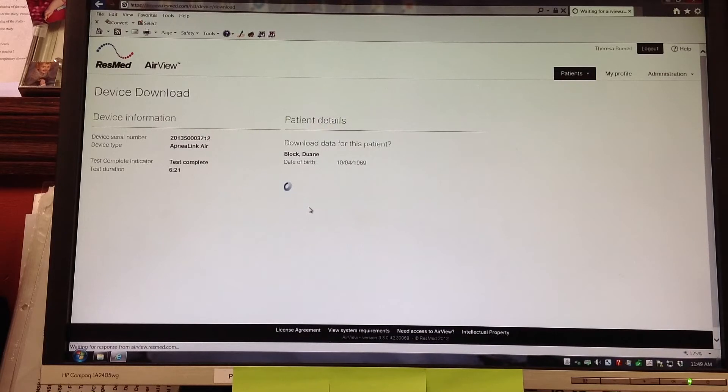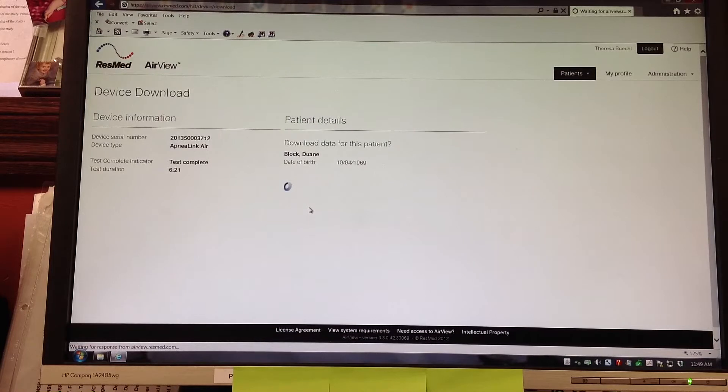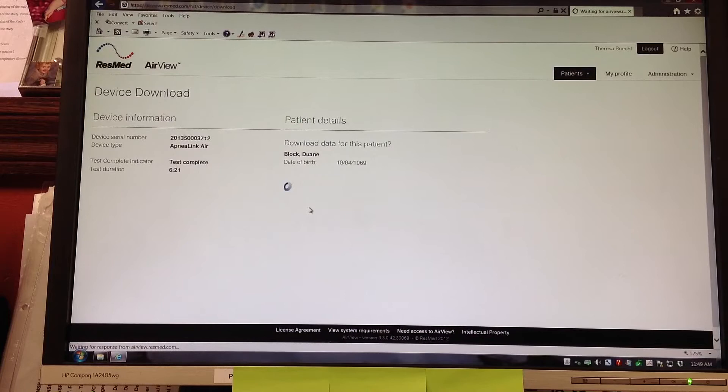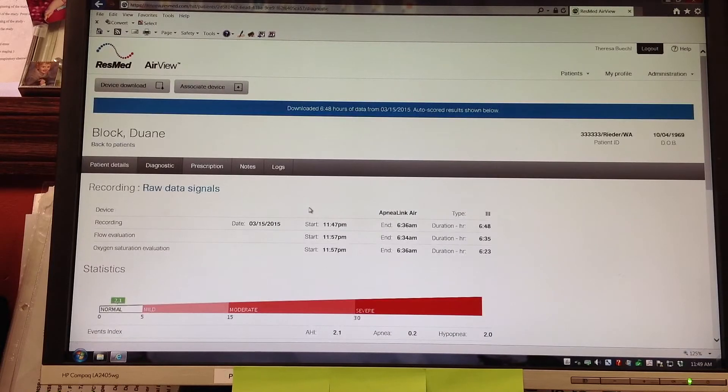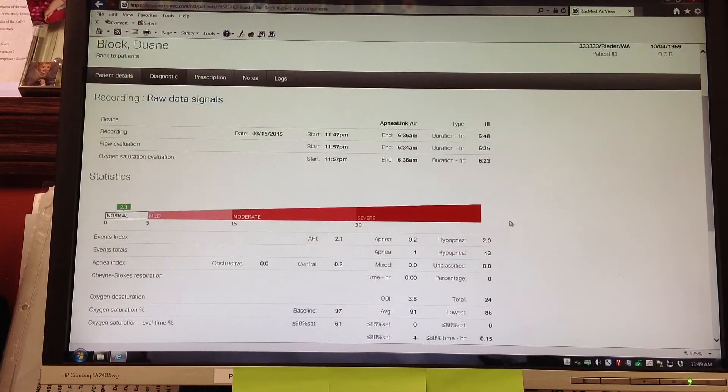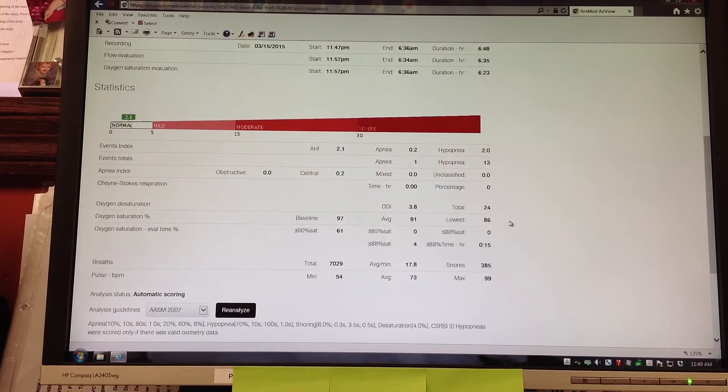If this device had obtained 2 nights of data or 3 nights of data, it would pick the night with the longest time period on it to download. This only had one night of data on it.